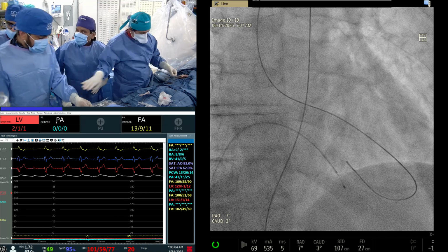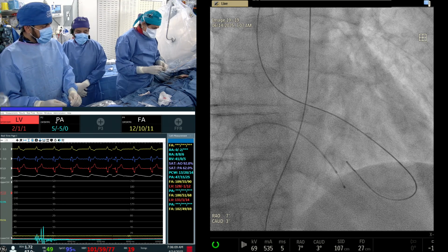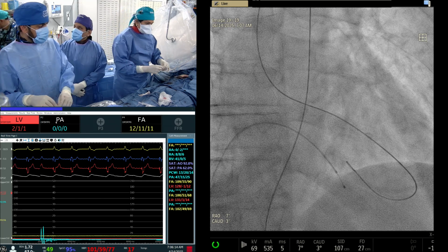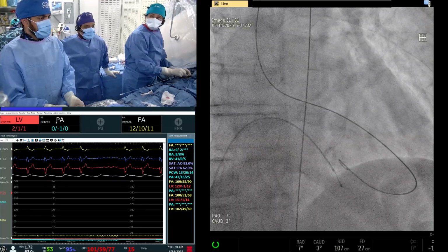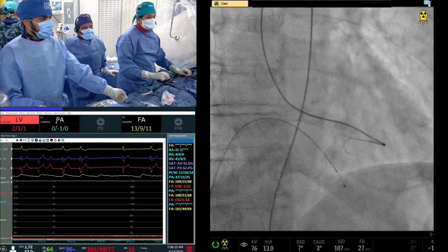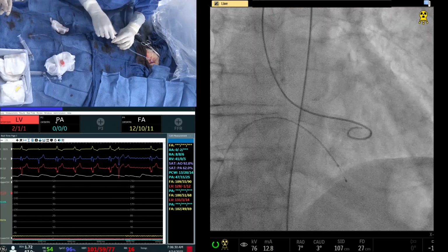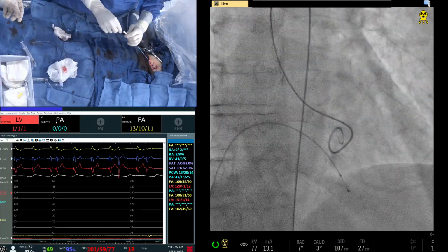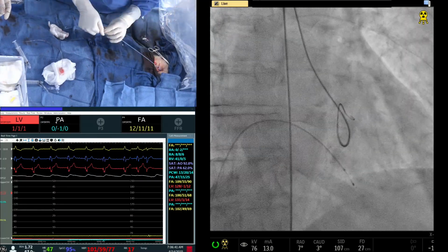Any questions about it? As I said, peak velocity is 4.5, so can the TAVR be done? It could be, but this is kind of complex, you saw the subtotal left main, so coronary is the preference, and we dissociate them. I know many trials actually did the TAVR at the same time. Yeah, there's a small study published in EuroIntervention that compared PCI before TAVR, simultaneous, or PCI after TAVR, that clearly showed more events when we do PCI and TAVR together. Yeah, absolutely.